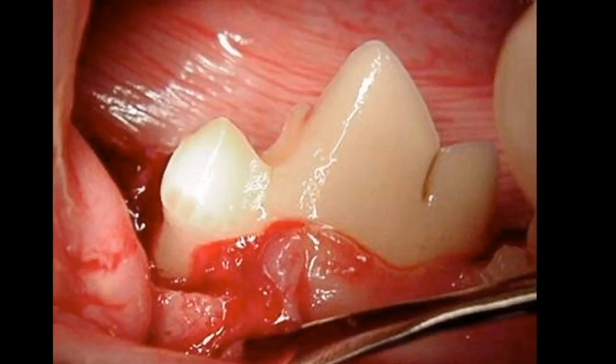If we've got enough room, which we would in this case, around that defect where we can get that cylindrical burr in without damaging the tooth, we'll take that cylindrical burr down in there and eliminate the fine granulation tissue that exists after we use our curette. So we go down in there with our curette and do the best we can and do that quickly and without really worrying too much about hemostasis.